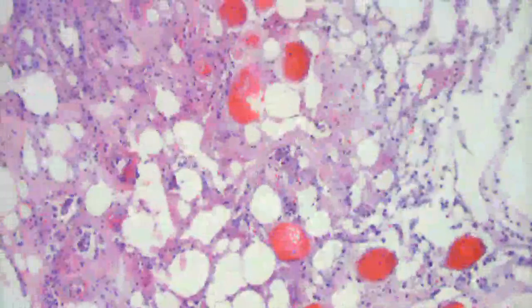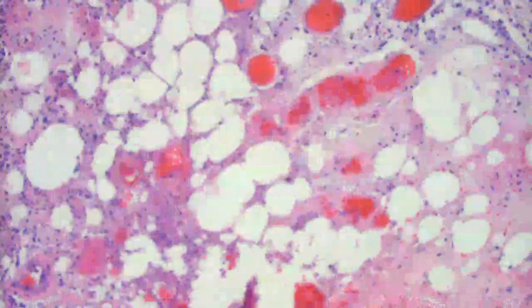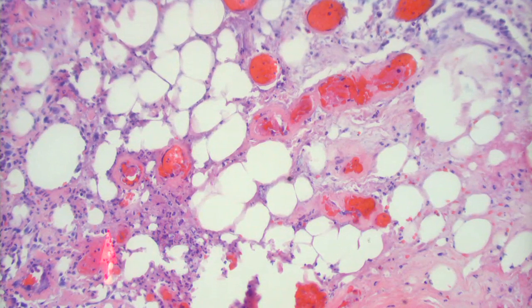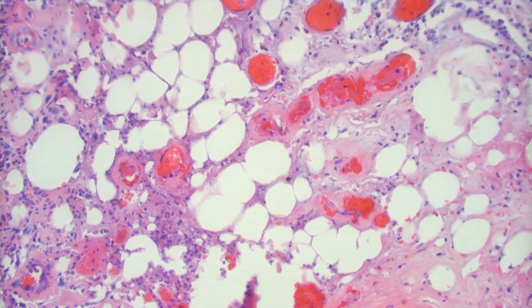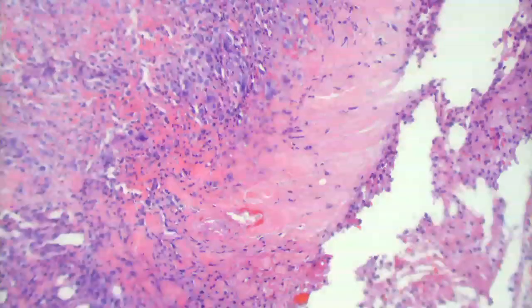There is a vasculitis here, karyorrhexis, but then the cause is... And there's really not that much karyorrhexis, though, is there? Most of these are intact neutrophils. So you've got all these blood vessels, fibrin, thrombosis, intact neutrophils, degeneration of fat, and a superficial, sort of punched out ulcer.